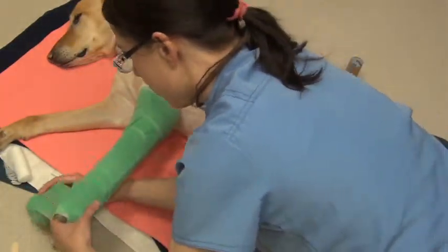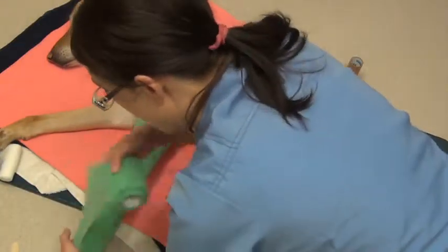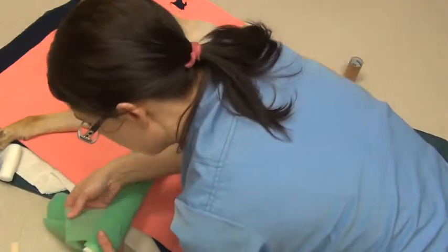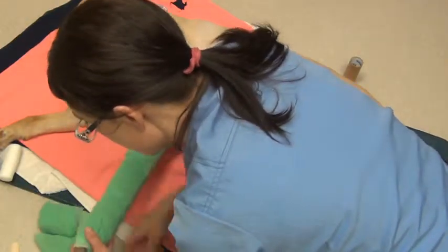Her toes are still out, for good measure. Again, I'm going to make sure that I keep it light. This bandage is almost finished. She's been a very good patient.